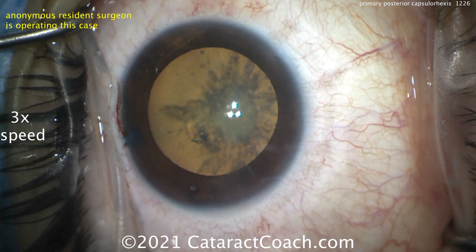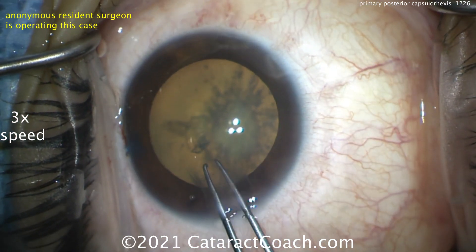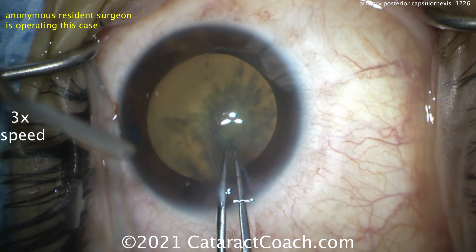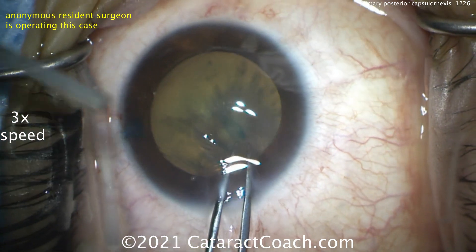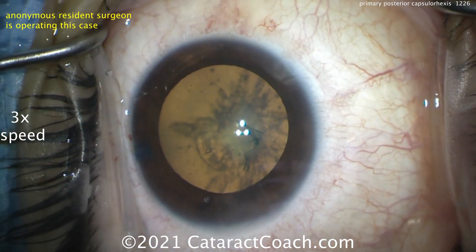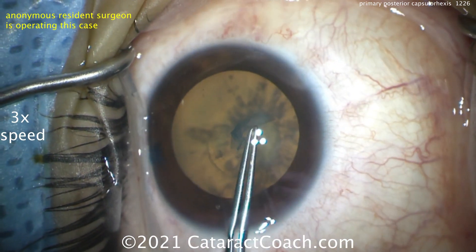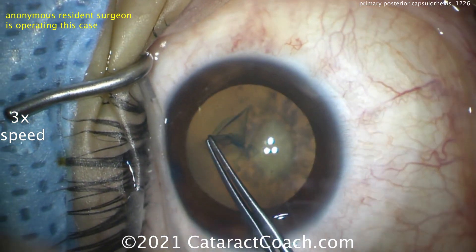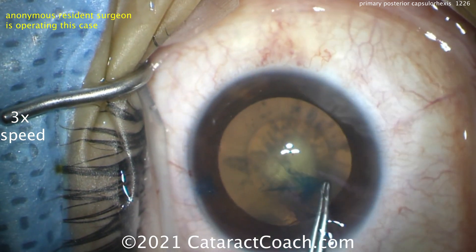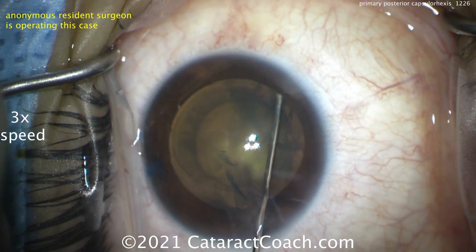The nucleus is soft enough that it can be removed with just the IA probe — you really don't need ultrasonic energy here. This is for sure not a posterior polar cataract. We've seen this patient years prior in our resident clinic, and she never had a prior history of a posterior polar. Plus, when we look at that type of cataract, it doesn't have that characteristic polar delineation or demarcation line. The rexis is nicely centered, about 5 millimeters — maybe a little on the small side, which I'll take.